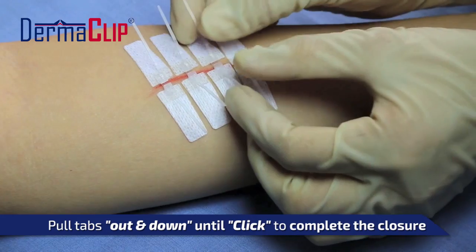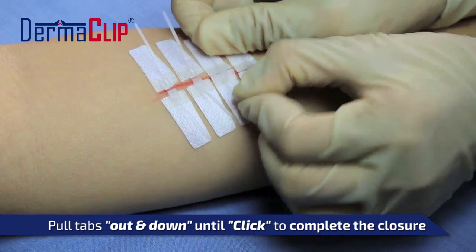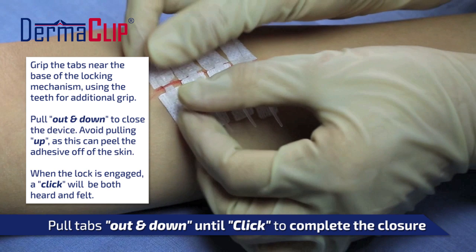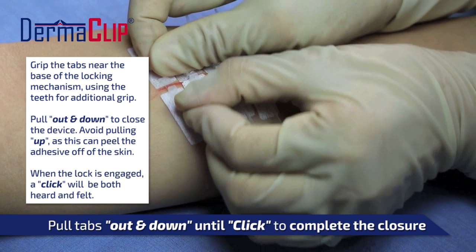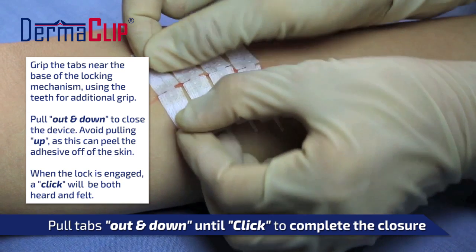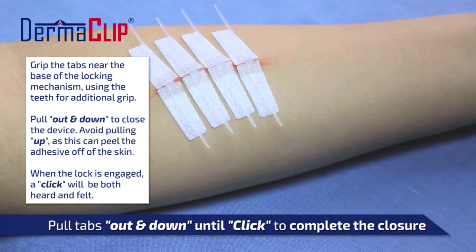To lock the devices, grip the tabs near the center of the device and use the gripping teeth. Pull the tabs in opposing directions in an out-and-down manner until the click is felt and heard. It is important to pull the tabs in an out-and-down direction, as pulling up can start to pull the device off of the skin.